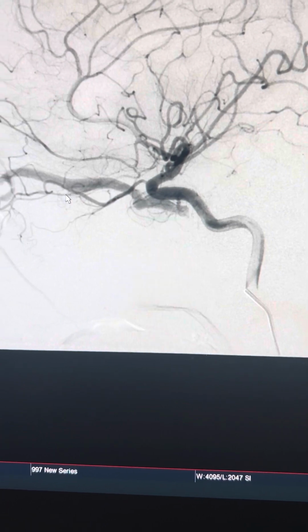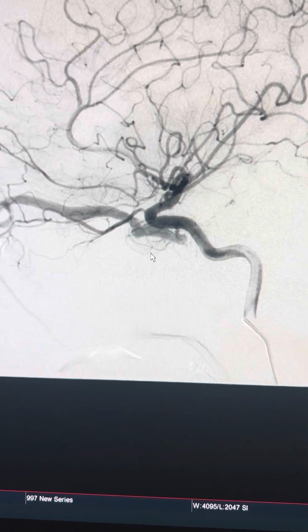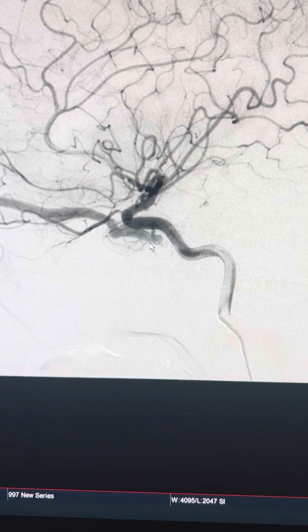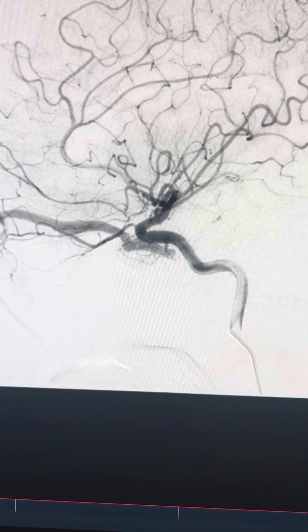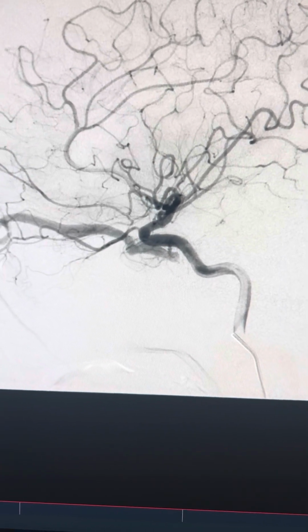So the treatment has to be by embolization, obviously, and the aim was to try to control it from the external carotid and hope that we can fill enough of this vein so that this will be controlled. So what we did, we went in with a microcatheter that has a balloon. So this is a balloon microcatheter. You can probably appreciate here the small markers over here.